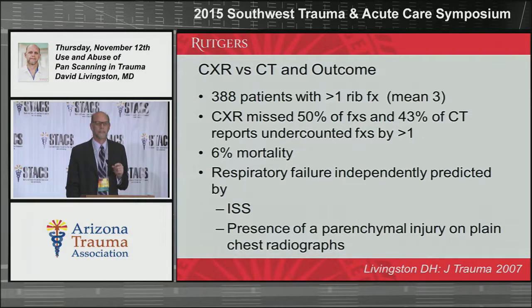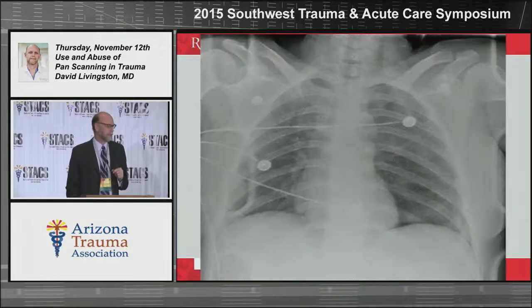CT did nothing to predict respiratory failure, those patients who required intubation for more than 48 hours. It was worthless. Any finding on your chest x-ray was important. In other words, so that word screening, if it was big enough to see on the chest x-ray, it was really important. And this is a nice example. This is from the study.